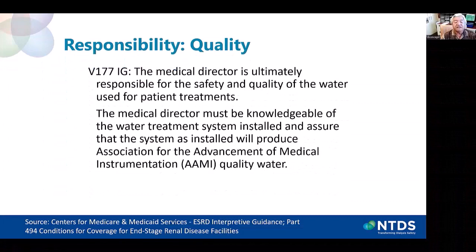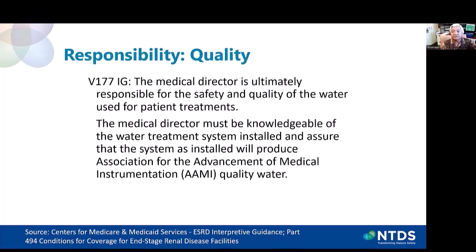The interpretive guidance is the CMS conditions for coverage for end-stage renal disease facilities that detail the regulations that must be followed in order to receive Medicare payment. Simply stated, the medical director is ultimately responsible for the safety and quality of the water used for patient treatments, and the medical director must be knowledgeable of the water treatment system installed and assured that the system as installed will produce AAMI quality water.